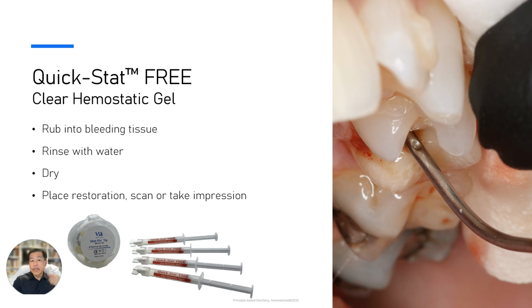Again, it's the only hemostatic agent I use today. And I don't scrub it into the tissue like we've been taught with some of the other hemostatic agents. You've got to scrub it, and then maybe rinse. And if it's still bleeding, scrub it, and rinse. And if it's still bleeding, scrub it again.